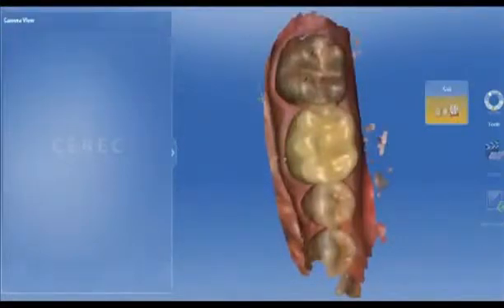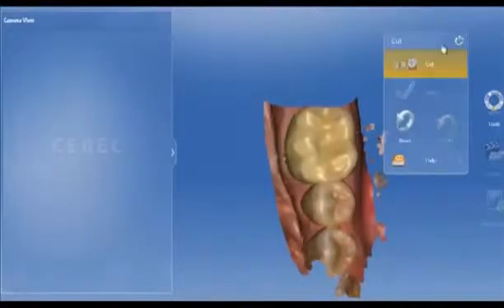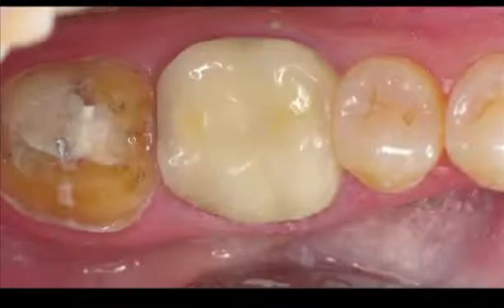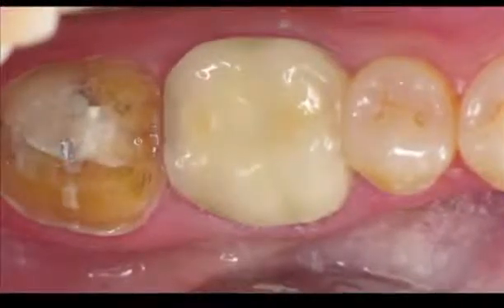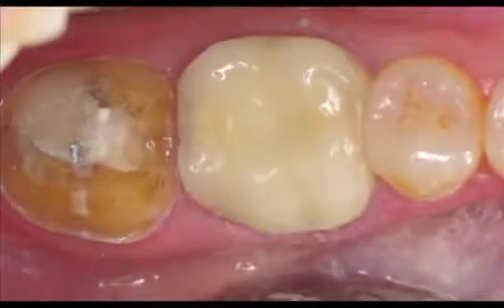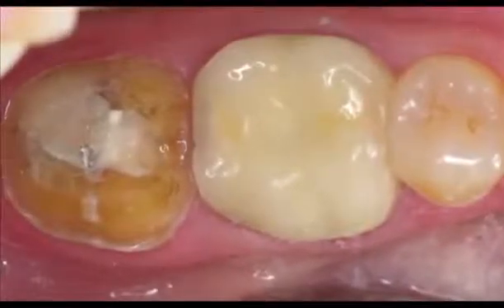As we get this quadrant imaged in three dimensions, we're going to save one file as the preoperative file, and the other one is going to be our basis for our prep file. The gold crown is cut off, and you can see the recurrent decay on the mesial, which wasn't too bad actually, but it did get up underneath the buildup to some degree. I thought, I'm just going to get the buildup out and make a new one.